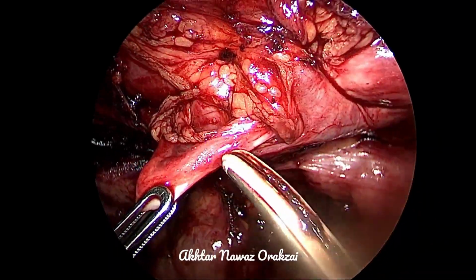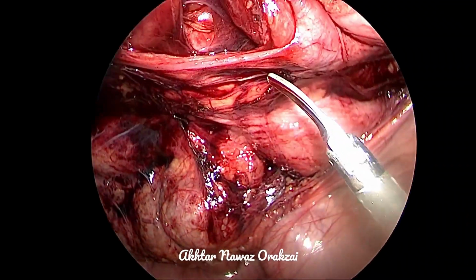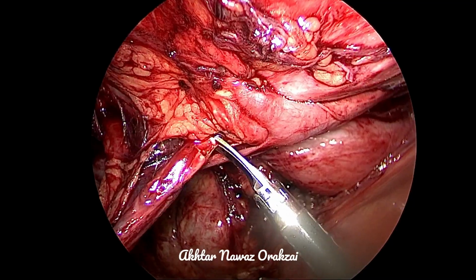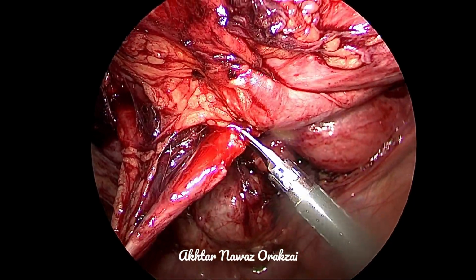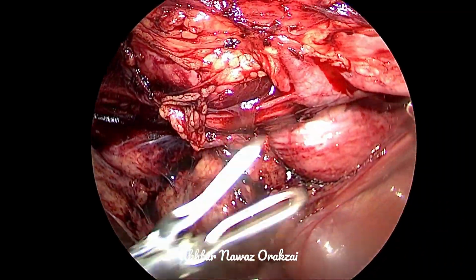Here you can see that the segment has come down very easily, so it is mobilized from all sides. And then we cut the ureter. We can cut it above or we can cut it below. So we have decided to cut below.